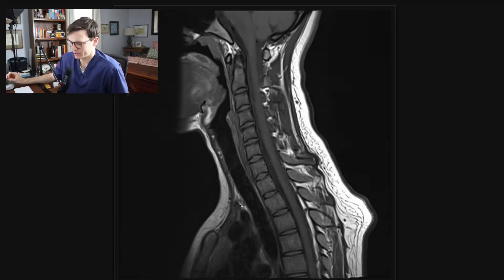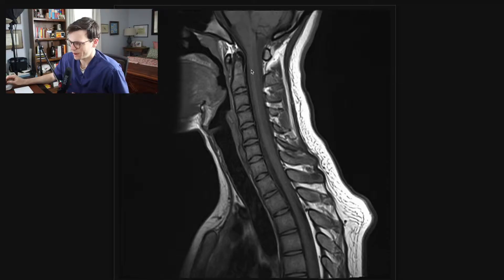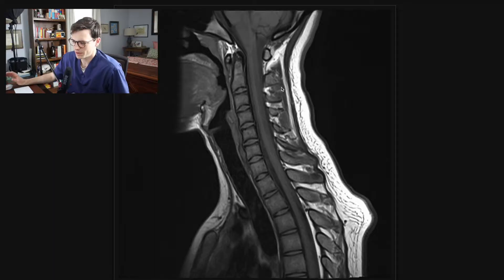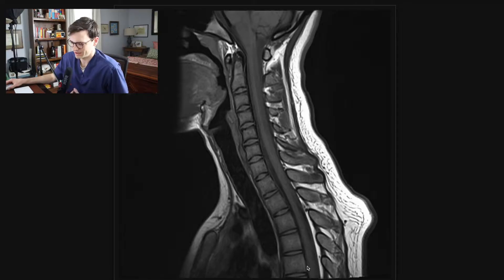After looking at all the bones in their entirety, I think about the alignment of the cervical spine. I pay attention to the cranio-cervical junction and the alignment of C1 with the skull base — in this case that is normal — as well as the alignment of C1 with C2. After thinking about the cranio-cervical junction, I pay attention to the alignment of the vertebral bodies, tracing a line along the anterior aspect of the vertebral bodies, then along the posterior aspect, and I look for any significant listhesis.